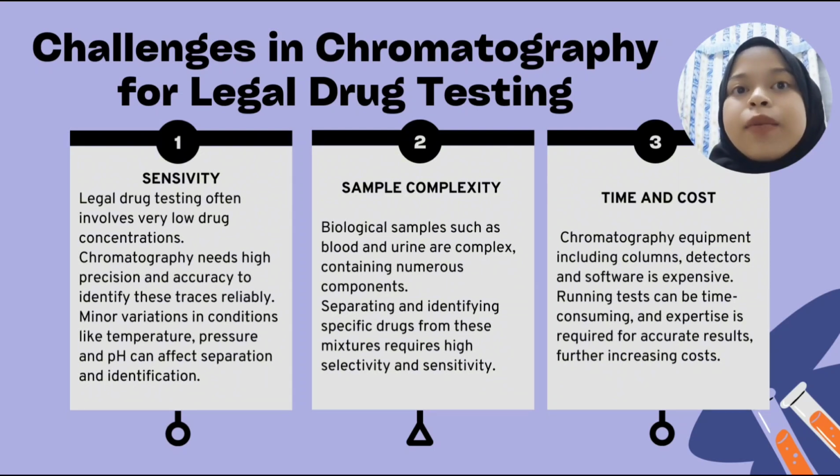And lastly, time and cost. Chromatography equipment, including column, detector, and software, is expensive. Running tests can be time-consuming, and expertise is required for accurate results, further increasing cost.